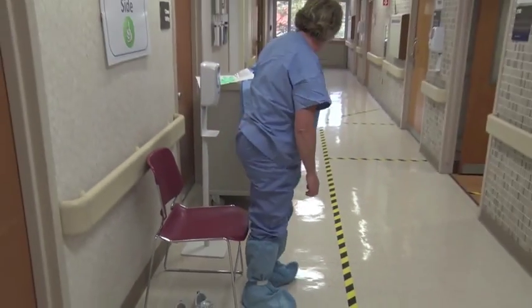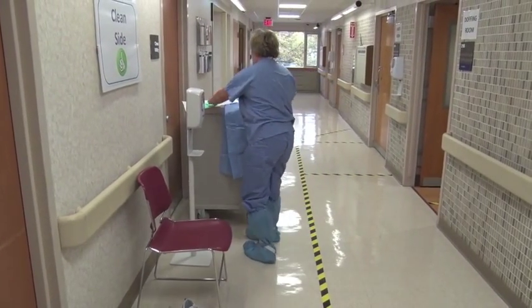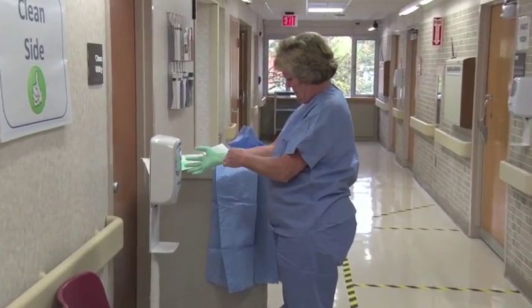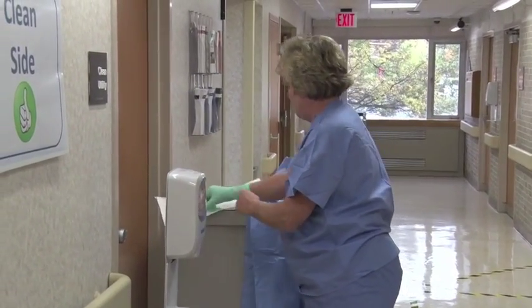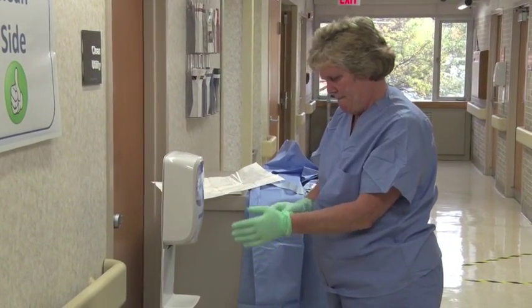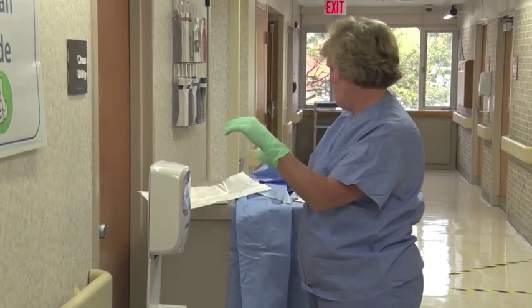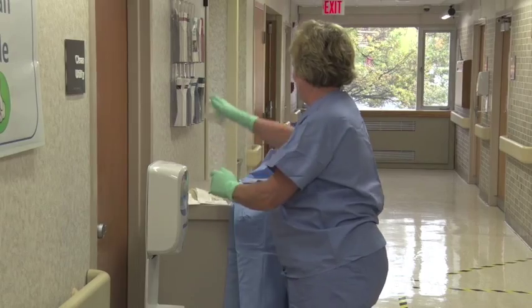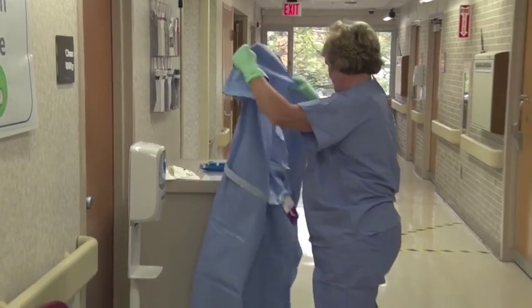Next, put on the first pair of extended cuff gloves. These are the inner gloves — the Allotouch green nitrile gloves. Put on the impermeable surgical gown.